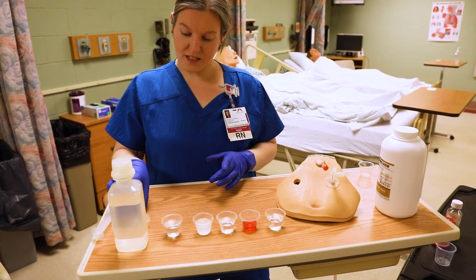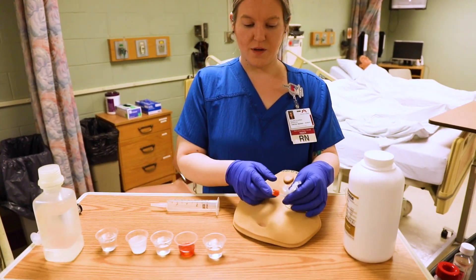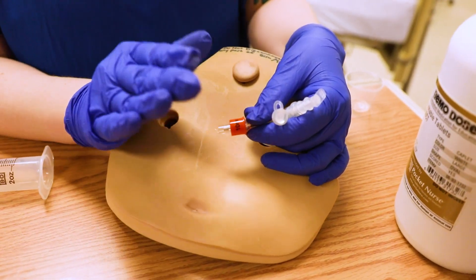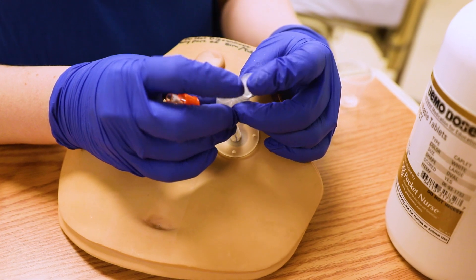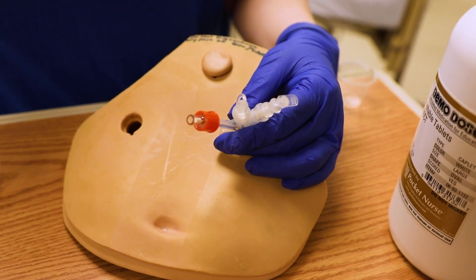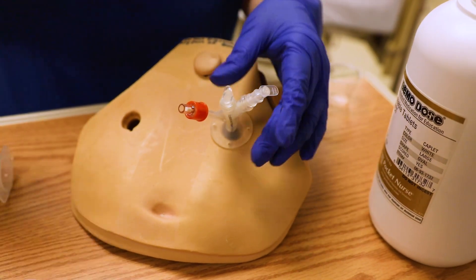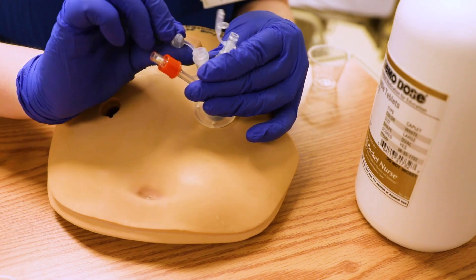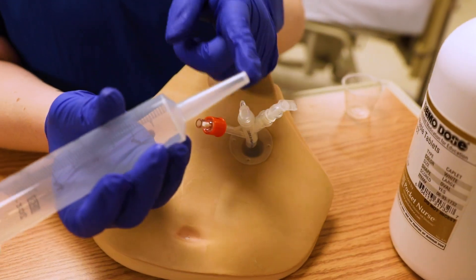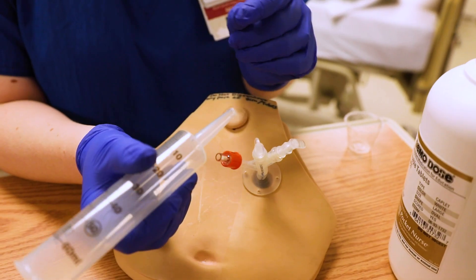We've already verified placement. On this tube, the port labeled 10 ml's is the balloon that holds it in — do not touch that. The other two ports are typically one for food and one for medication. I'll take a peek to choose the right one. The syringe I'm using is a toomey syringe — it could be a 60 ml syringe — but make sure it is not one with a luer lock, which is the type you connect to an IV.